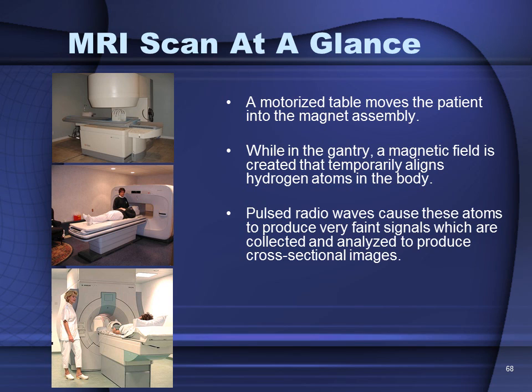Open MRI can be used for individuals who are claustrophobic. And the images that are reconstructed by these techniques can be produced in any plane. This is similar to multiplanar reformatting. Most recently is vertical MRI, in which a patient can be in the seated position while the MRI scan is being taken.